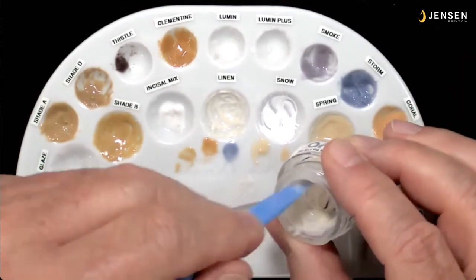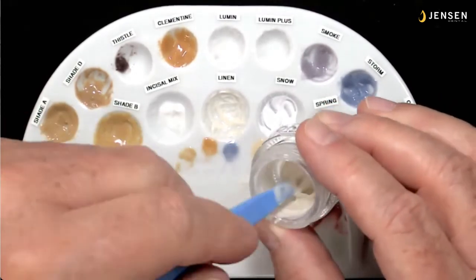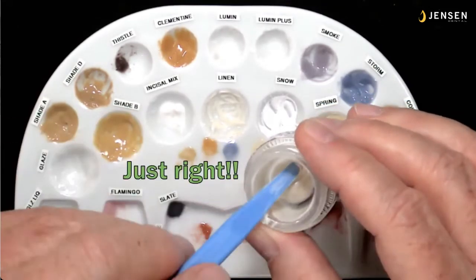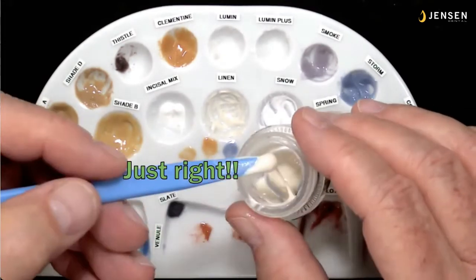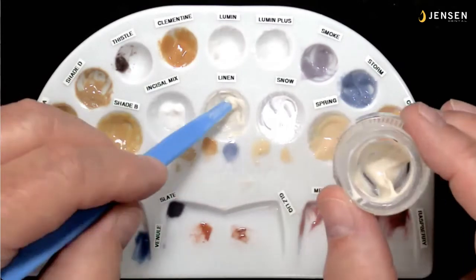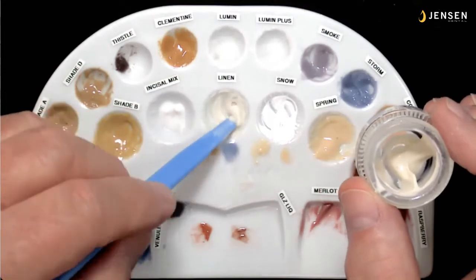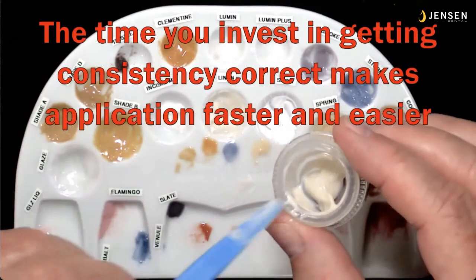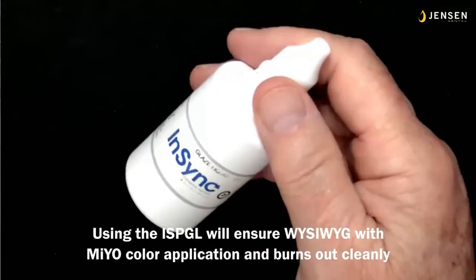And after you mix 5 or 6 or 8 jars, you're going to get an idea about what it takes to reconstitute these things. So I thought about half to 2/3 of a drop. I mix it up again, mix it up real well when you're adding the liquid, maybe 8 or 10 seconds. And I look at it and it's just right. Of course, I've been using this material for about 3 years, so I've gotten used to the consistency of it. And you want to mix it up well with whatever's in your well. The time you invest in getting consistency correct makes application faster, easier, and makes your job a lot more fun.